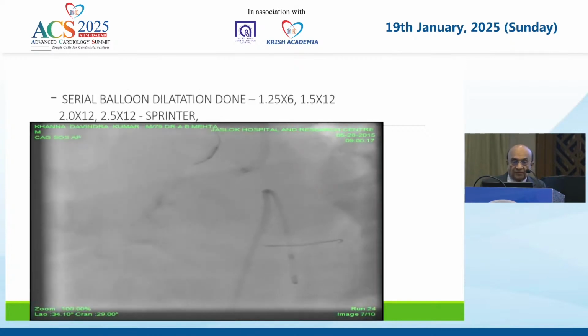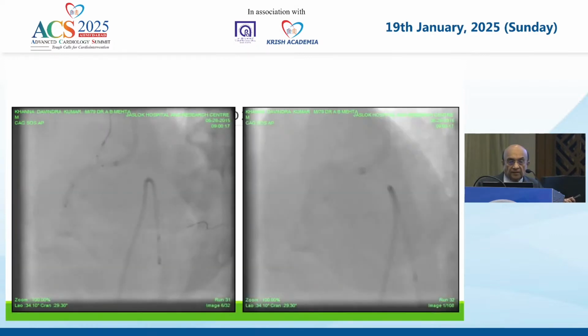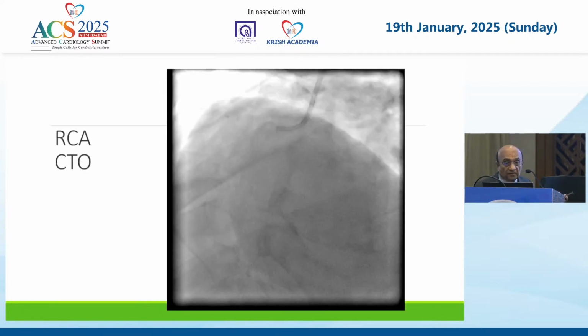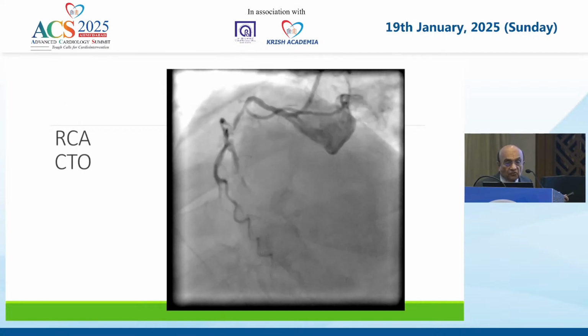Thereafter, I tried to enter and did serial balloon dilatation, and delivered the stent, and that was the final result, which I think, I'm not sure, I'm sorry about it.